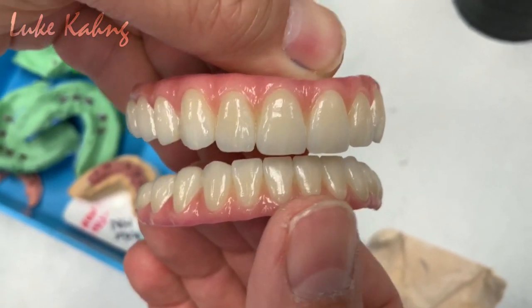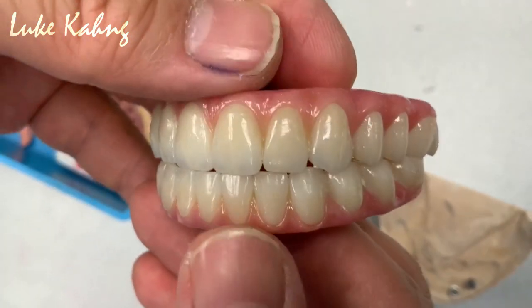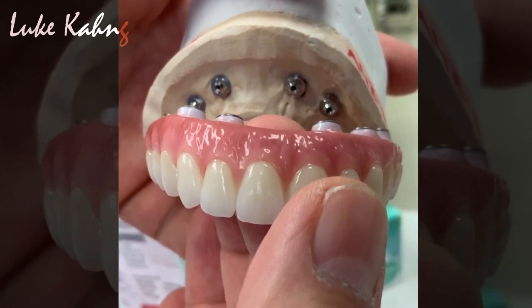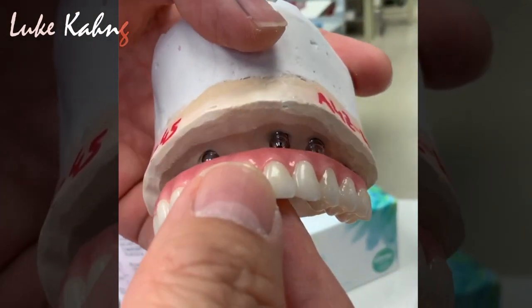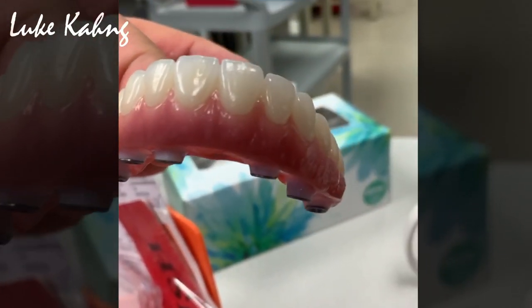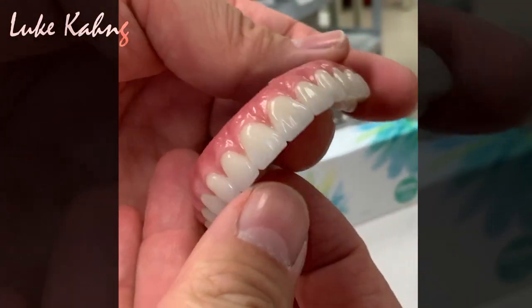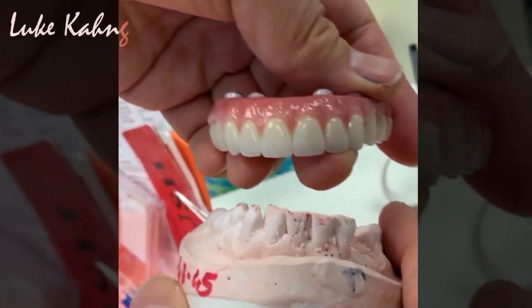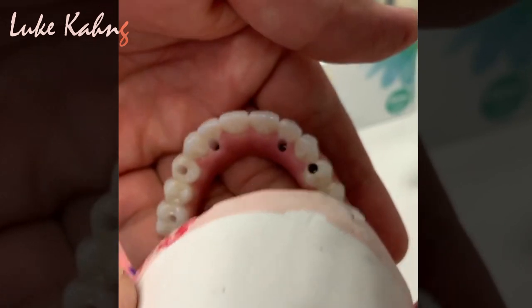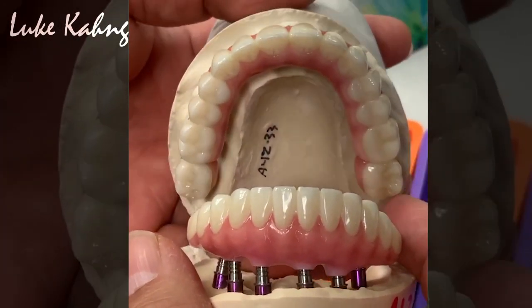Okay, this is Saiten 4500. Nano with the layer. Great. There's another great one, Saiten 4500. It's cemented with a Ti-base. This monolithic here. So this is the bite, especially lower teeth. Whoever has natural teeth is really careful about the oral occlusion. Okay, great final.